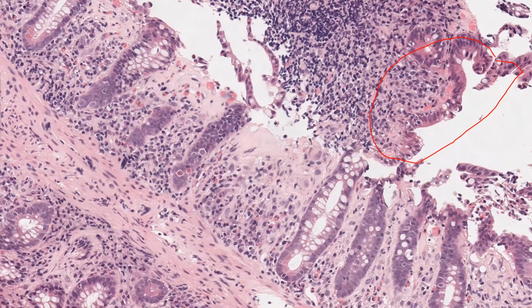You see, what tends to happen for these questions, what do we mean by the stripped epithelium? This epithelium shouldn't be stripping off, meaning coming out. As you can see, the segment of this epithelium was supposed to be in its place, settled and happy here.